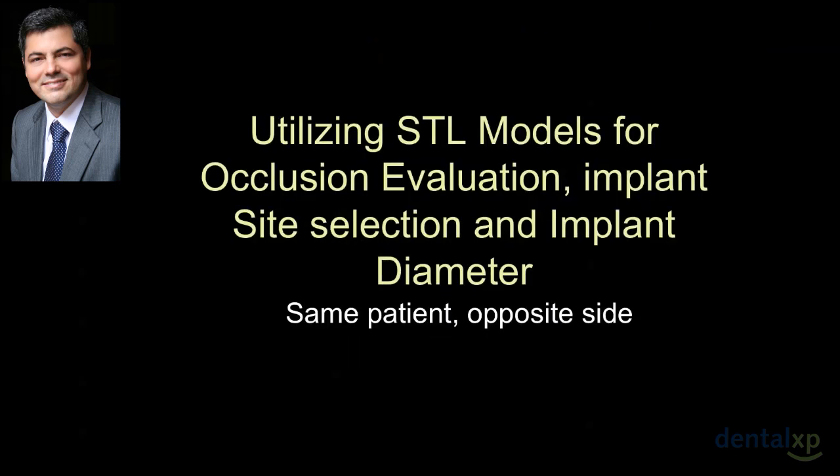The STL models, the actual optical scanning, becomes a great tool for occlusal planning and occlusal diagnostics. We can actually today scan models, or we can even do intraoral scans, and we can utilize that information to examine the maxillomandibular relationships of patients. We can also use it to evaluate occlusion, to evaluate implant site, and to make our implant selection and implant diameter.